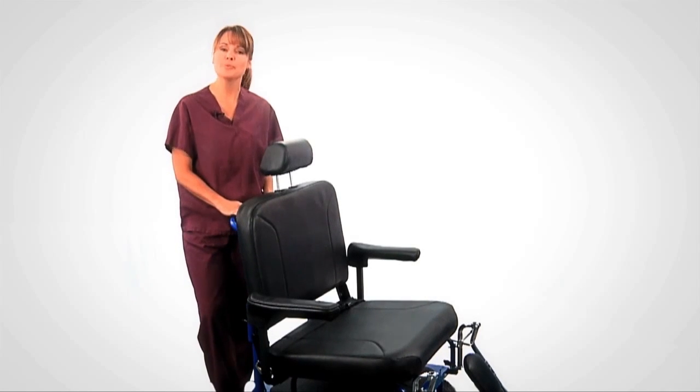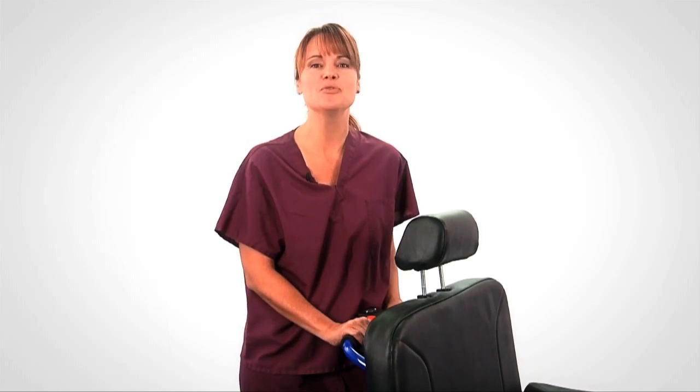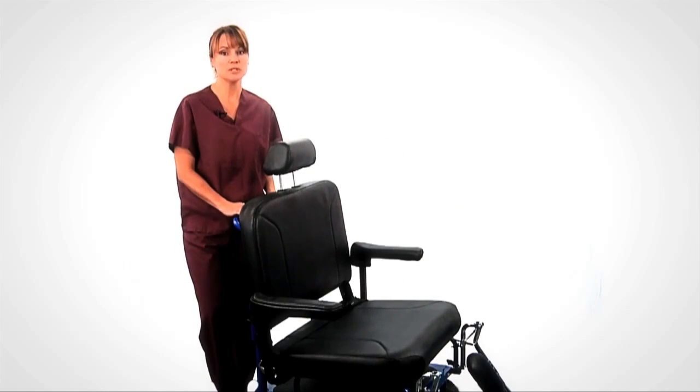Electrokinetic Technologies is proud to present the Breeze Electric Transport Chair. Safely move patients through hospitals and care facilities and easily maneuver through hallways, rooms and elevators. The Breeze powerful drivetrain puts less stress on both caregivers and patients.